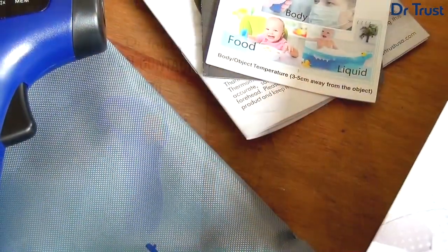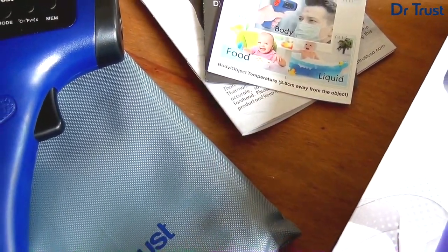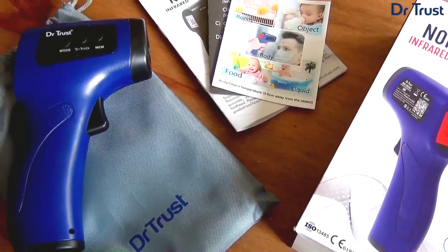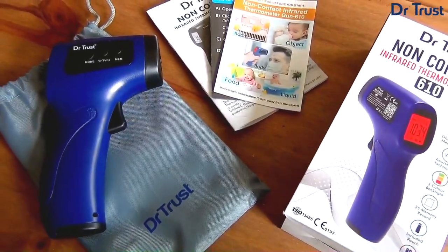Introducing the Dr. Trust Non-Contact Infrared Thermometer Gun 610, the simple, reliable and non-invasive way of measuring body, object and room temperatures accurately and easily wherever you are.